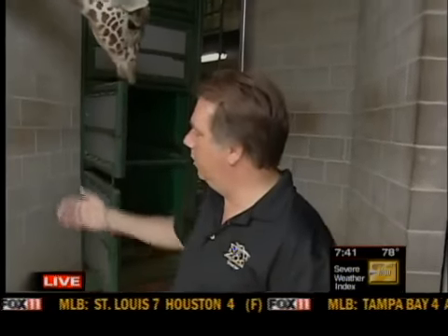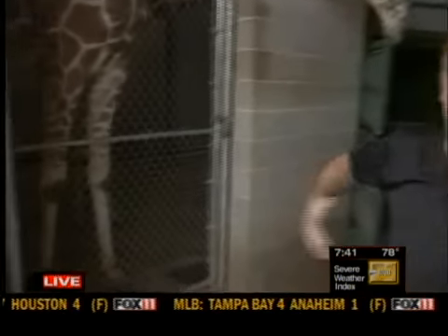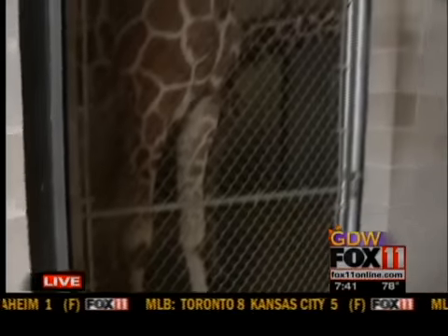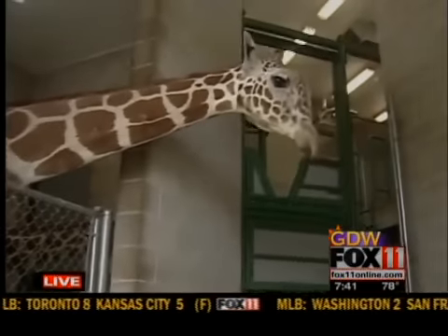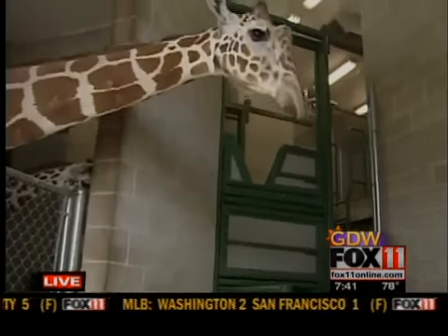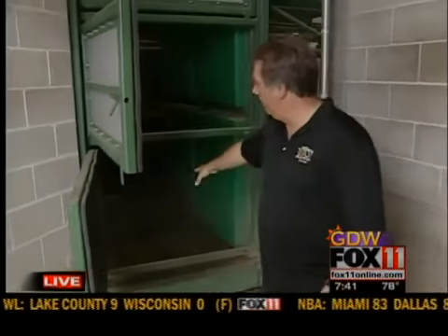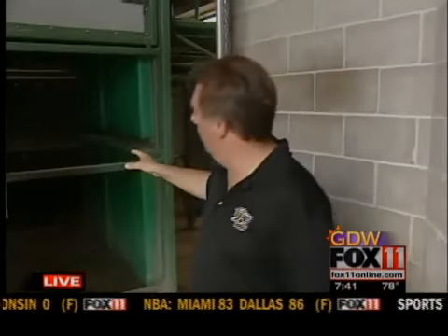We didn't know if it was something to do with the hoof, the leg, a shoulder injury, or whatever. So we kind of watched her, observed her, and figured out that it's got to be something in the hoof. Well, we were able to bring her into this machine here, which is our giraffe tamer system, which is nice because the giraffe can get in here, weighed. But over the years, we have been able to go ahead and work on her hoof to be able to lift her up and check that out.